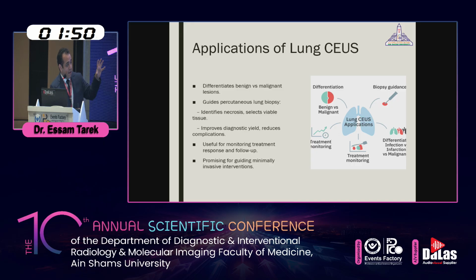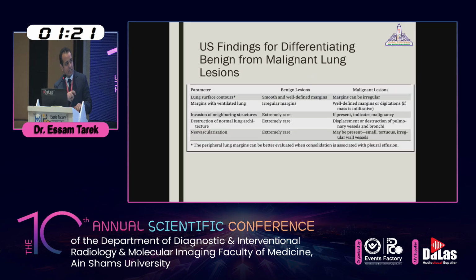So if we can use ultrasound to validate that the lesion is viable and not necrotic, I think it will increase the accuracy of our biopsy and of the diagnostic and interventional procedure. Also, if the lesion is highly vascular, I try to be more cautious because of post-biopsy bleeding or hematoma.